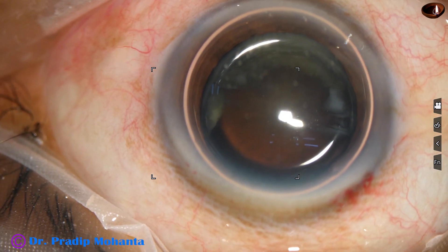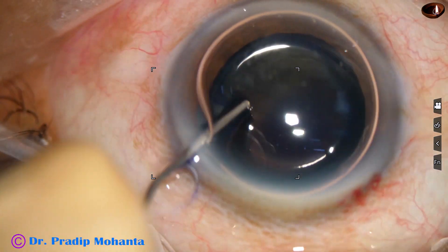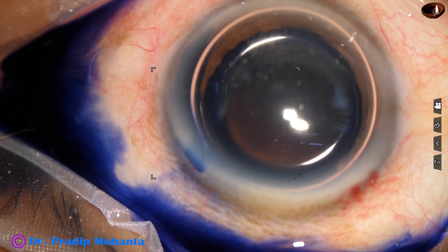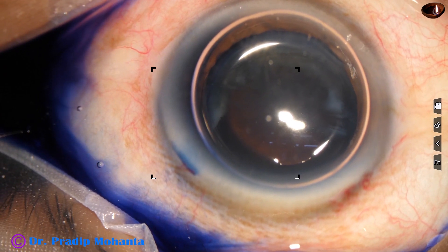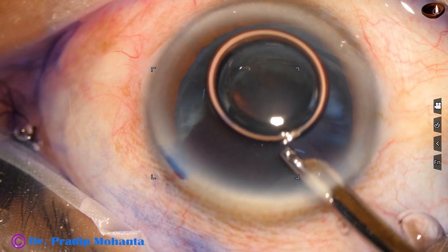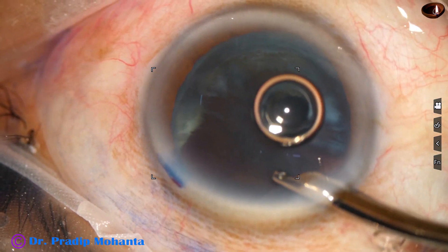After making the incisions, the anterior chamber is filled up with an air bubble. Beneath this air bubble, trypan blue dye is applied over the anterior capsule. If we apply the dye underneath an air bubble, staining is quicker. The anterior capsule gets stained in 15 seconds nicely if we use an air bubble.